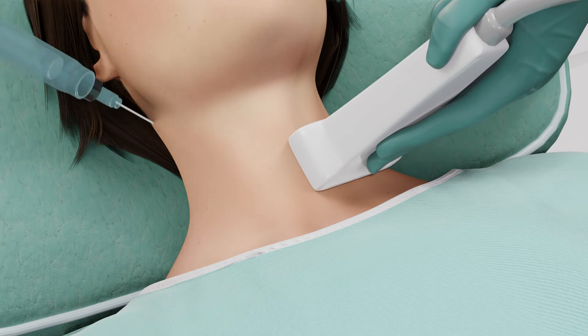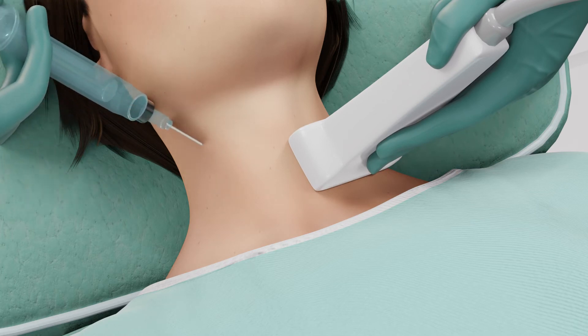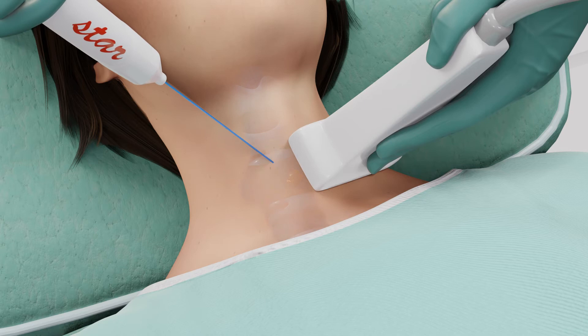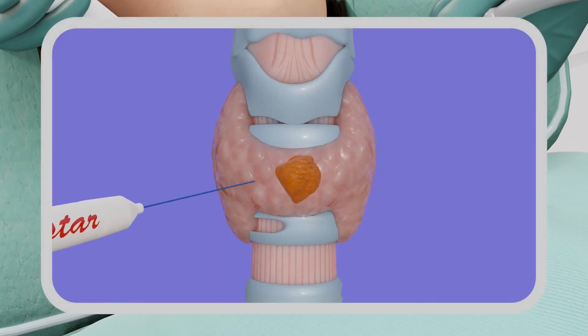However, there is usually not a significant amount of pain with this procedure. Under ultrasound guidance, the StarMed RFA electrode is now inserted and positioned into the targeted nodule. The RFA system is activated.